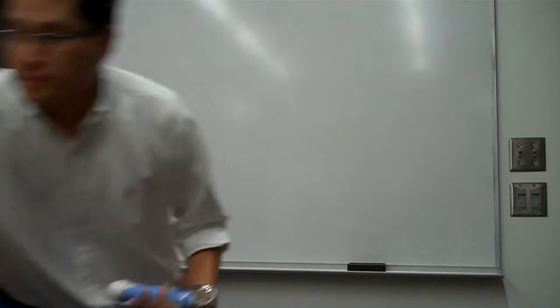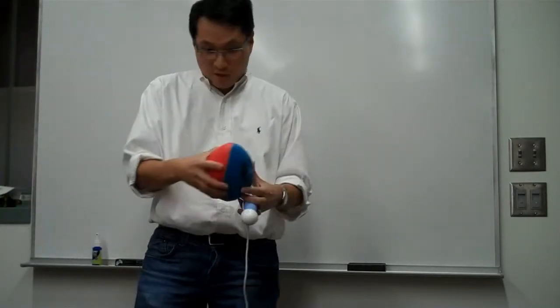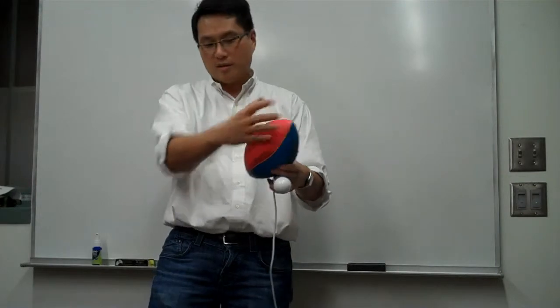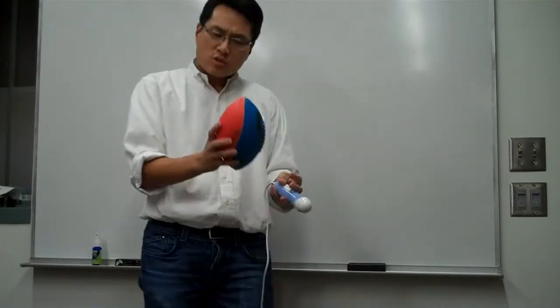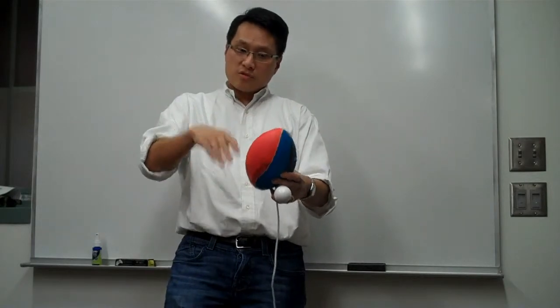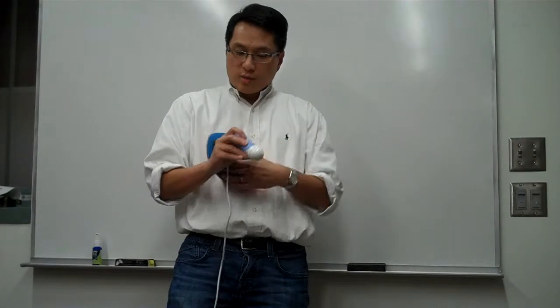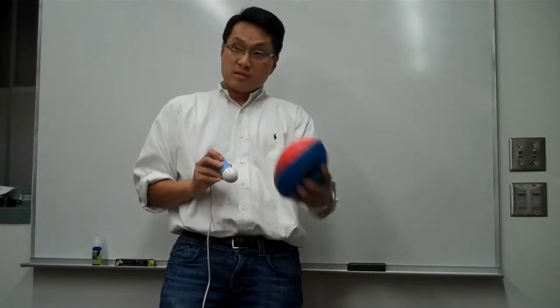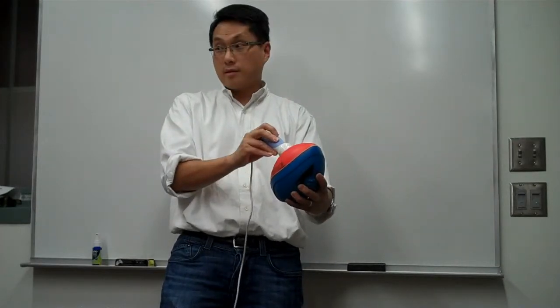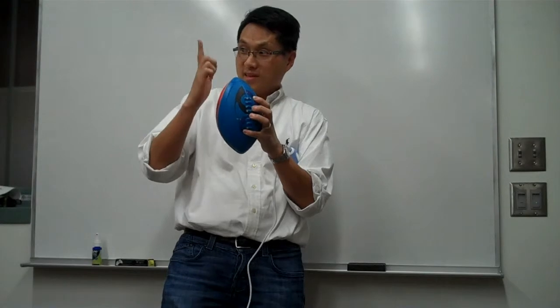For example, I think this is part of the video, but let's say, as a rough approximation, a human body looks like this, right? There are two main views, the longitudinal view and the transverse view. Again, the dot is this way, I'm cutting this way, so if the baby's like this and I'm scanning like this, the picture you get will be an oval, right? You guys see that?